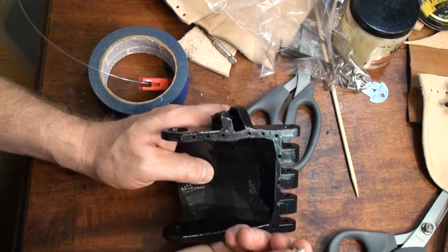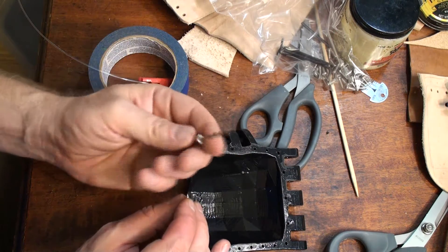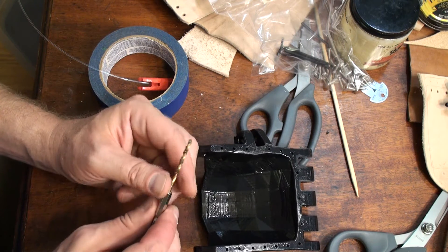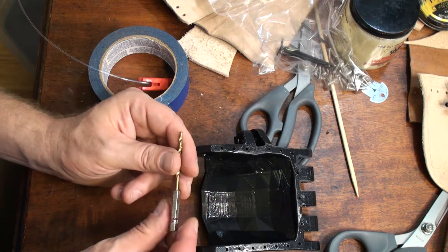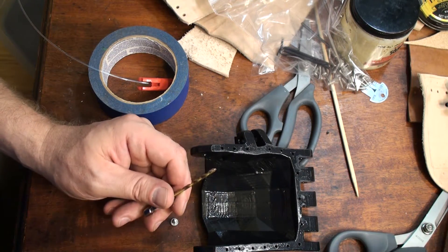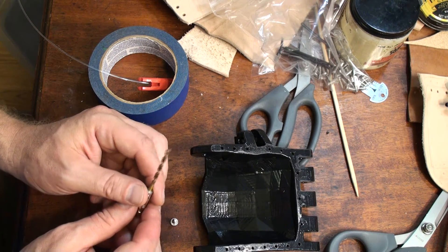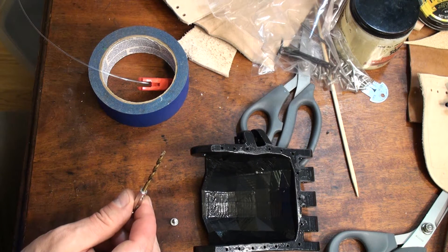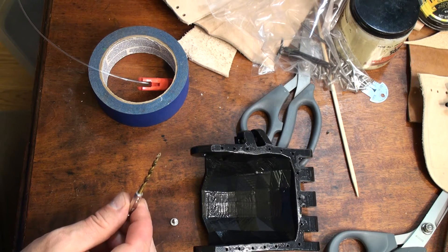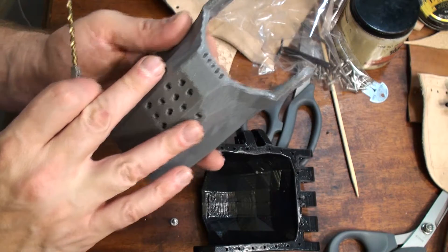For a number six screw in all the kits, it's the middle sized drill bit. In this case the middle sized one is the 1/8 inch. There's a smaller one which you use to ream out the fingertips, and then there's the larger one that you use to ream out the holes in the bracer. So for the bracer holes, the larger size drill bit is what you would use.